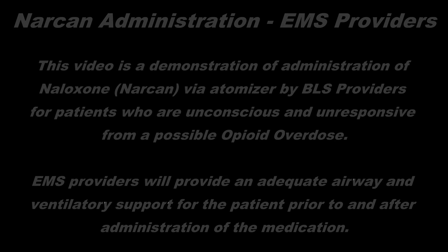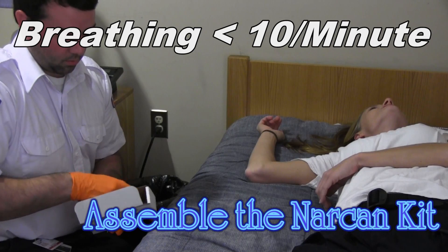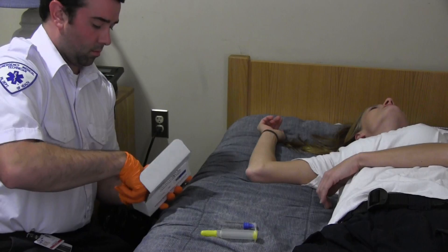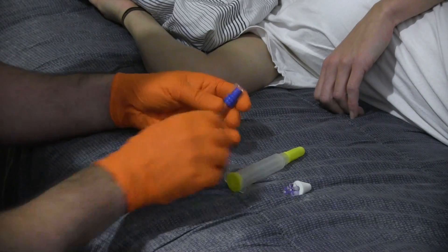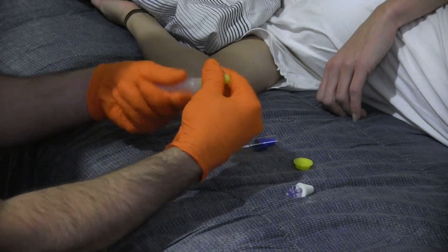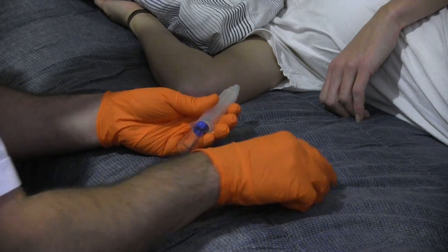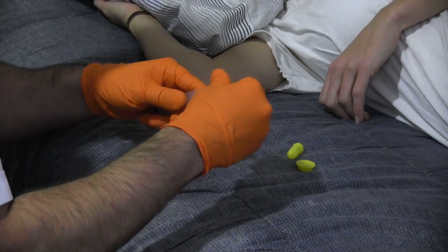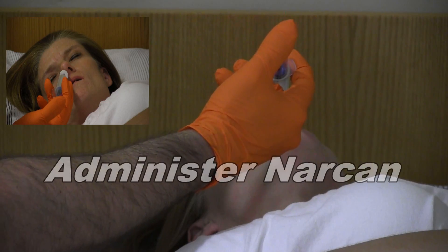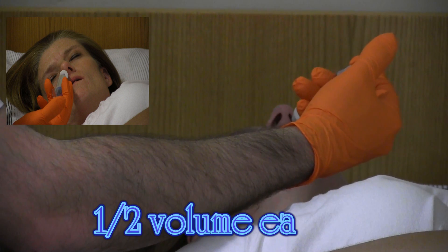Assemble the Narcan atomizer: pop the protective cap off the medication vial and hub, screw the medication vial into the hub using two to three turns, and attach the atomizer. Administer one-half of the medication fluid in the vial into each nostril.